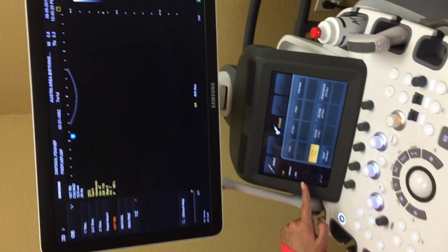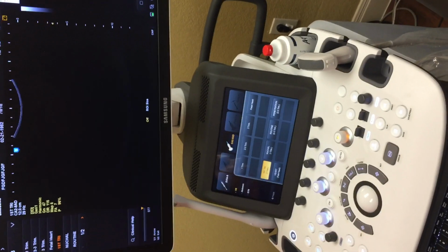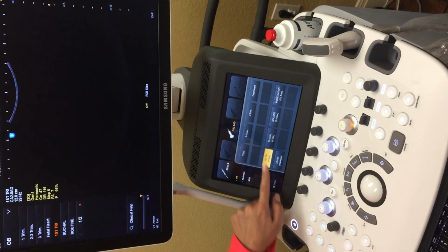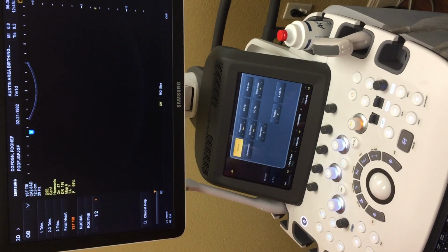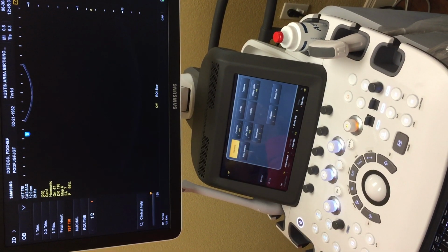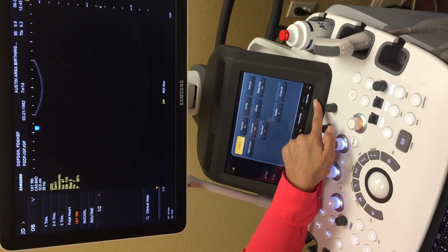Maybe show them on the early fetuses how you narrow the field, focus. Because at 6 to 7 weeks, the heart is really faint. So the first thing you would do is go to probe, first trimester. That would be your starting point. Say you were looking at that heart and you really wanted to hone in on that heart. This is your scan area.